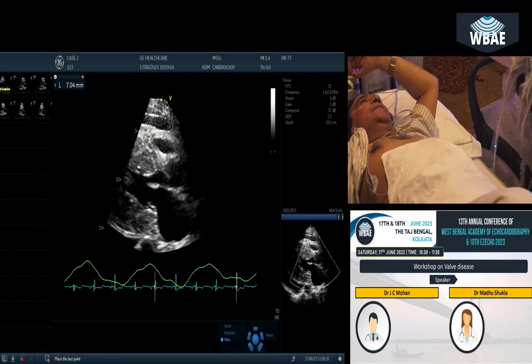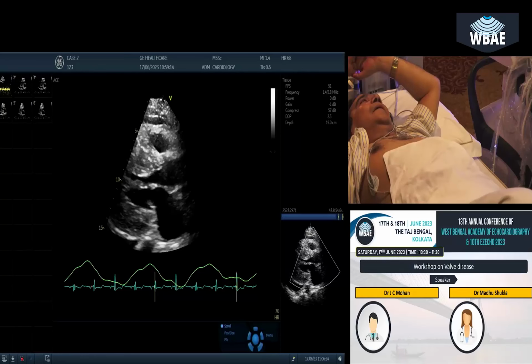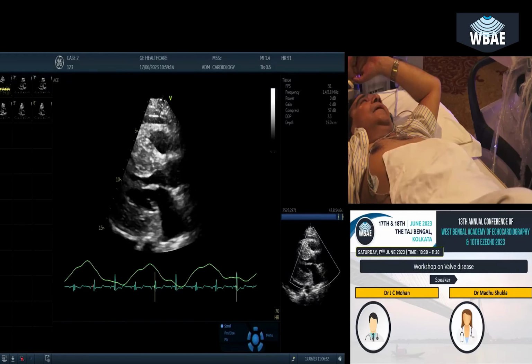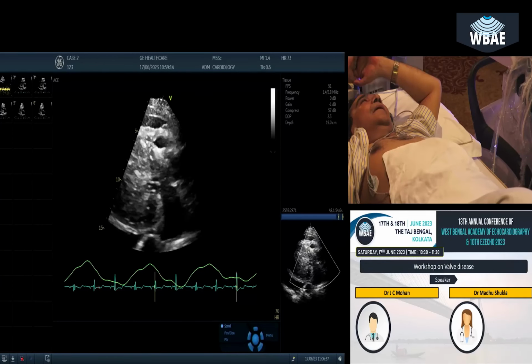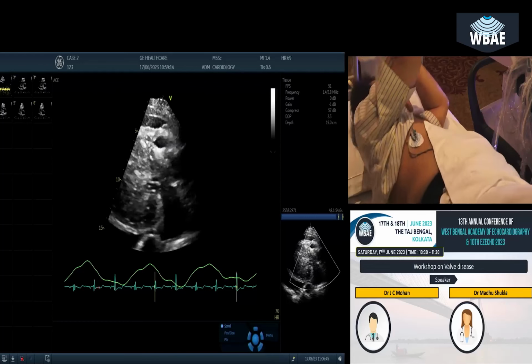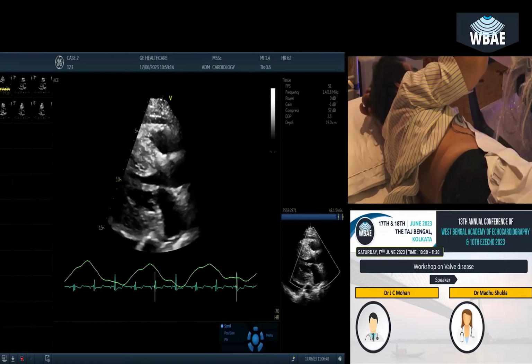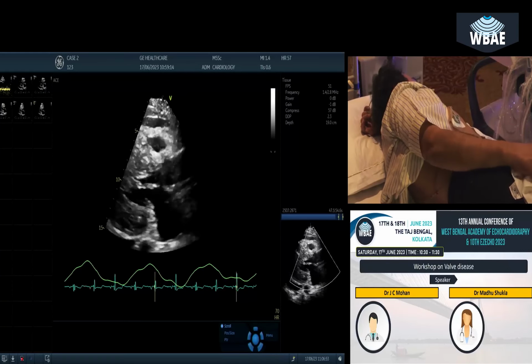But Dr. Madhu, let us look at the SAM. I will start from the diastole. This is end diastole, and then I'm moving into systole. It is closing and then moving anterior. I don't think the valve is moving, the whole cavity is getting smaller. But the next thing we should talk about is, where are the papillary muscles placed? Are they placed in the normal 4 and 8 o'clock position? And are there additional papillary muscles? Because those are features of hypertrophic cardiomyopathy.